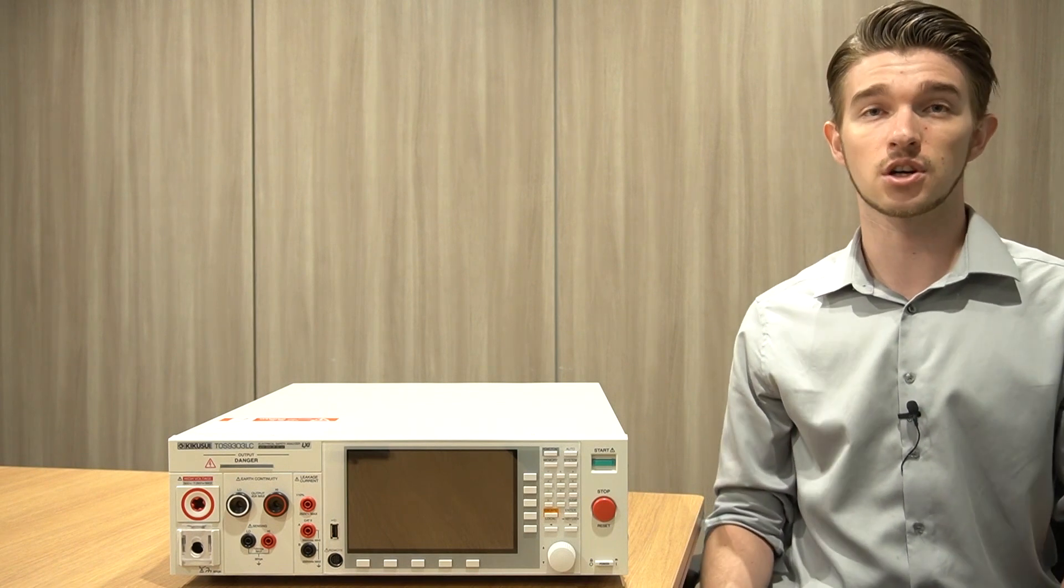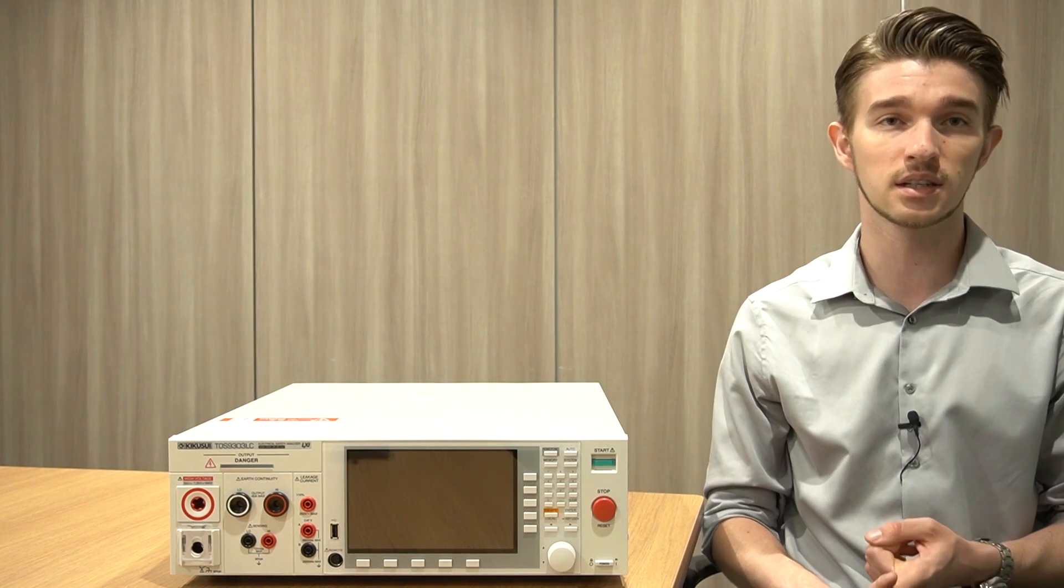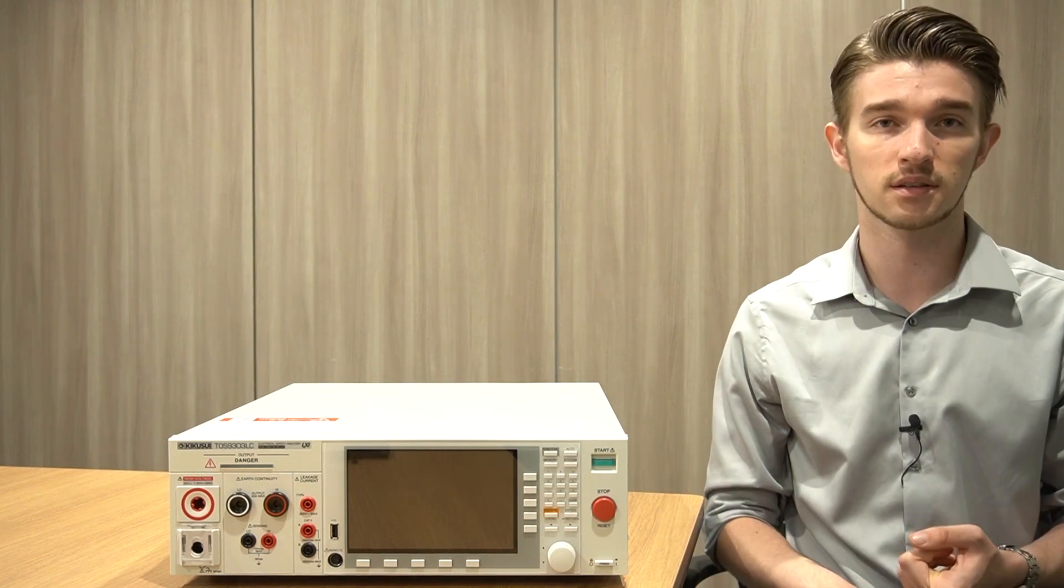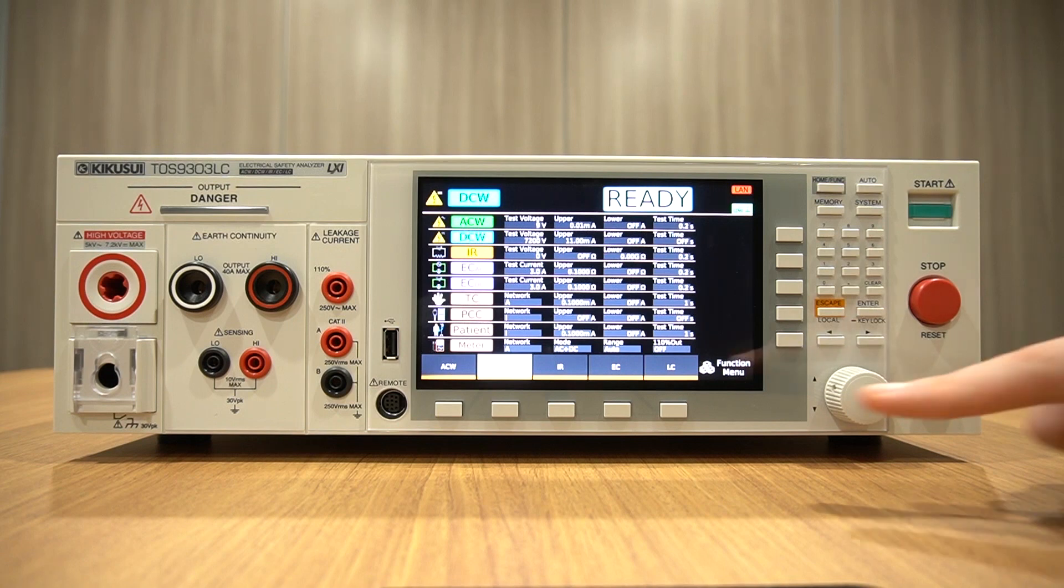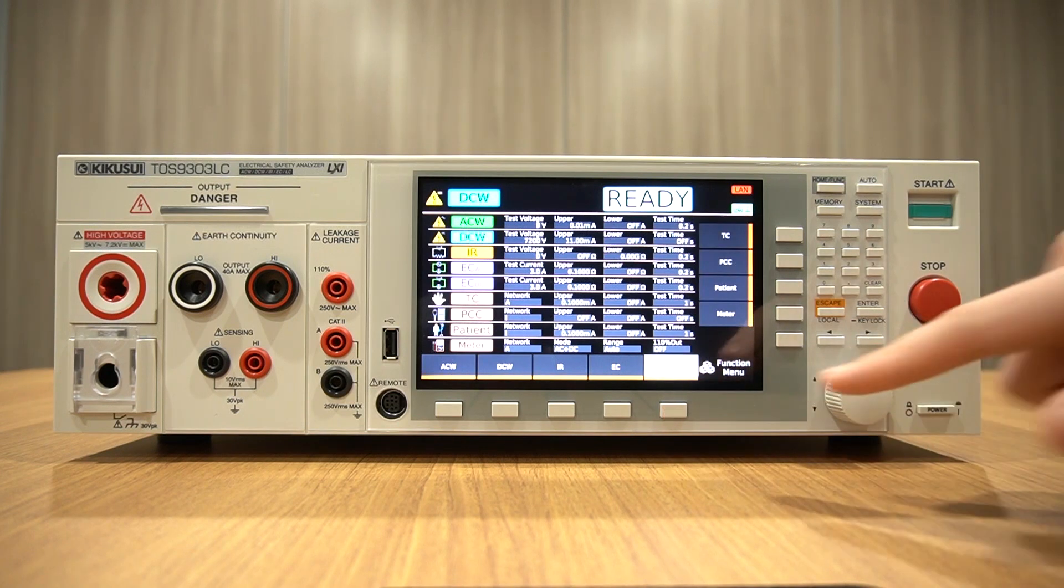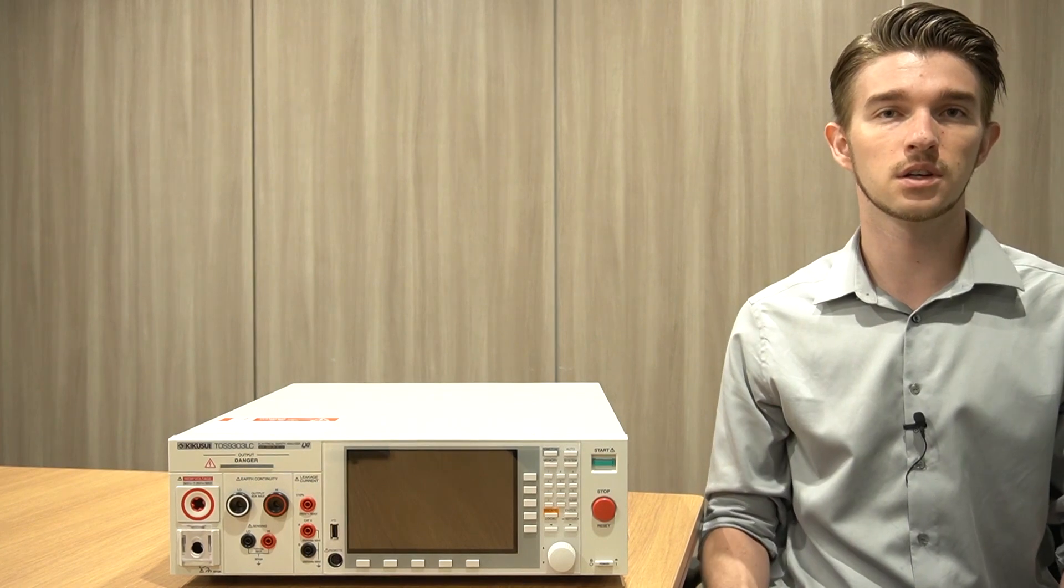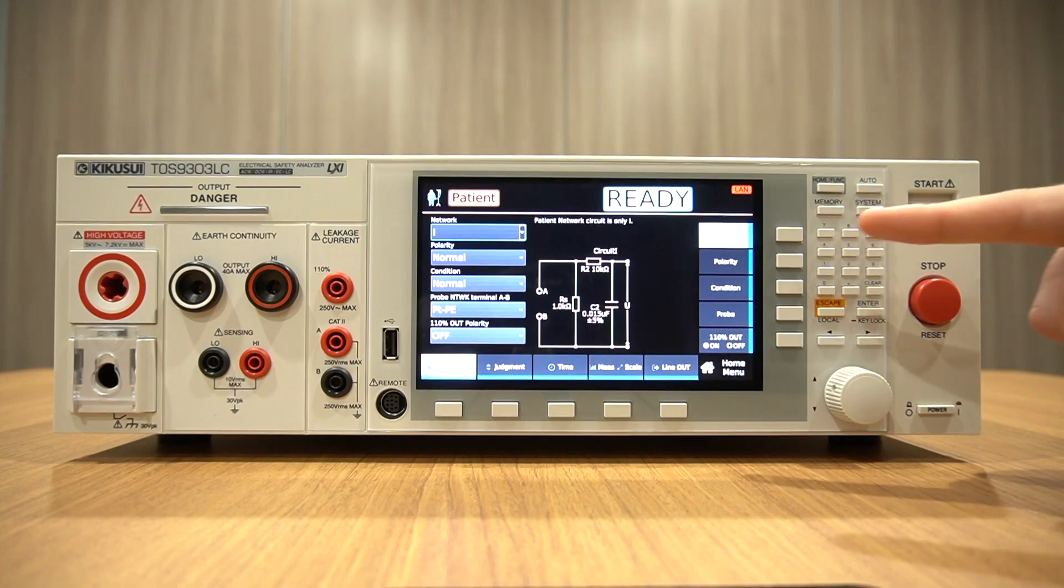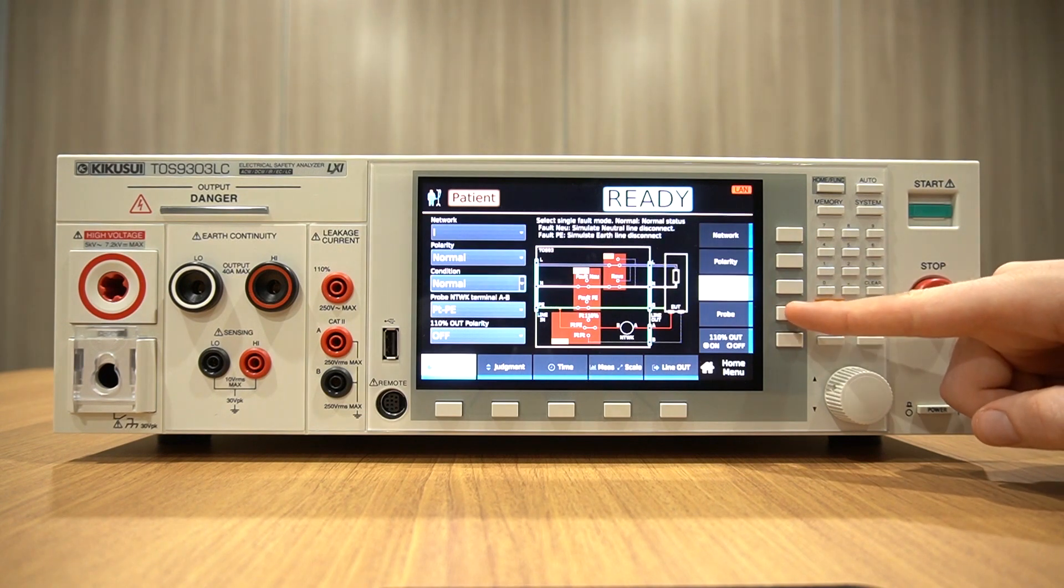Conducting a patient leakage current test with the TOS 9300 is as simple as setting test conditions, starting the tests, and making judgments. In order to make your test settings, press LC from the function menu screen, and then press patient. From here, you can configure a wide variety of settings, including polarity, upper and lower limits, test time, and measurement ranges.